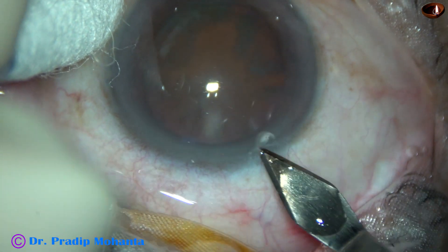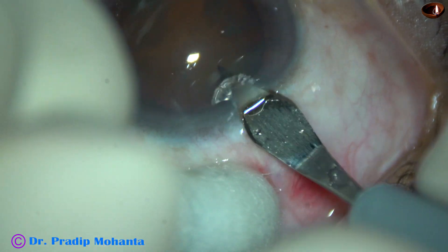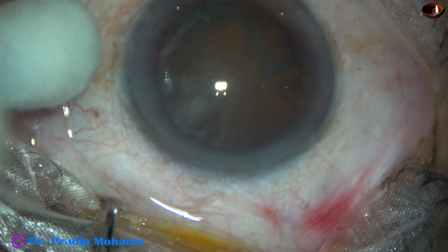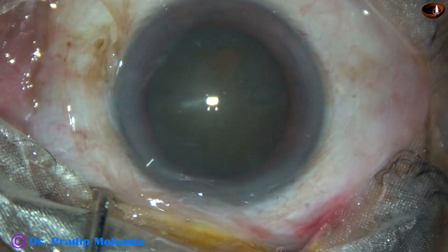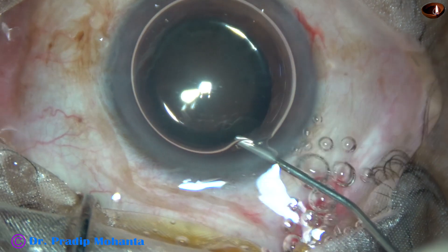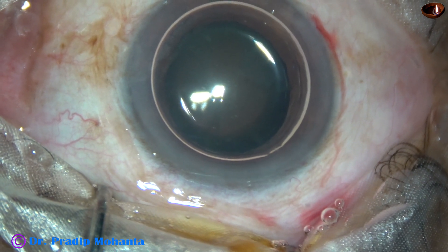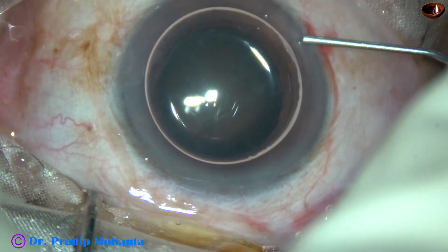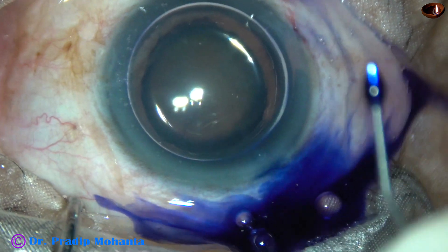This is the main incision with a 2.8 mm steel keratome at mid-limbus. This is a side port on the right side of the main incision. An air bubble is injected to fill the anterior chamber, and beneath this air bubble, trypan blue 0.06% dye is applied over the anterior lens capsule.